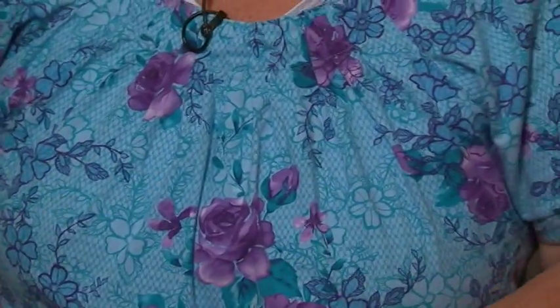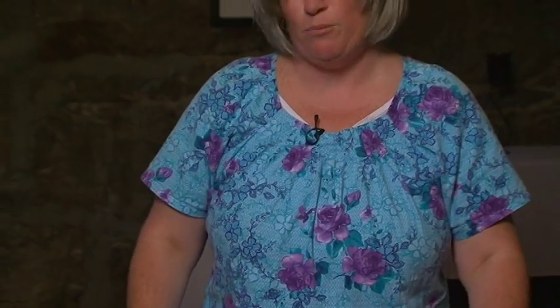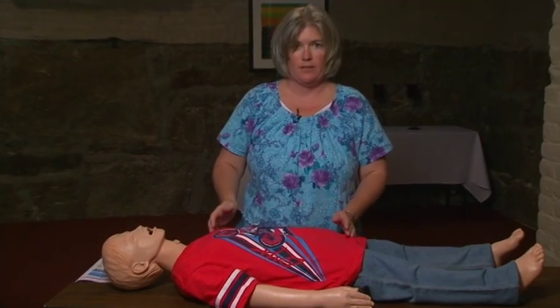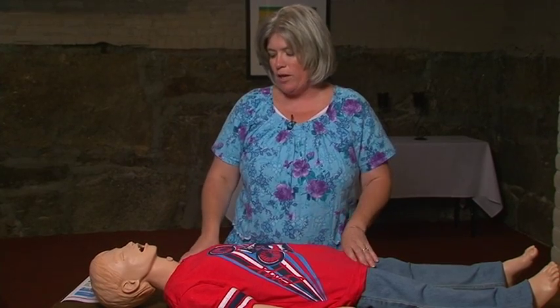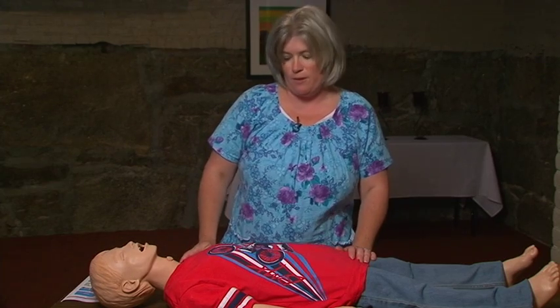Now we have Johnny here, who you're going to go on a field trip with, so I'm going to go through training how to give him Diastat. One of the things you look at is your order and see when is the time frame of giving the Diastat. So some of them are 3 minutes, some of them 5 minutes. So he's been seizing for approximately 3 minutes. So we're going to give Diastat now.